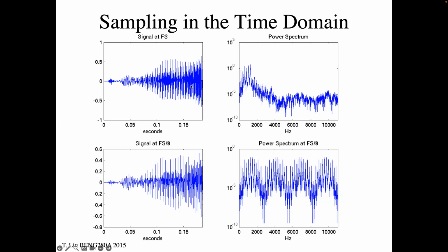So here's a time domain signal, say a voltage versus time in a coil. This is 150 milliseconds across here, and we're going to discretely or digitally sample that time domain voltage at a certain rate, and we're going to call it fs, right? So one way of asking is, well, what frequencies exist in this signal? I can take the Fourier transform of that signal and it will tell me. If this is time domain, this is hertz, or kilohertz, what the frequencies are.